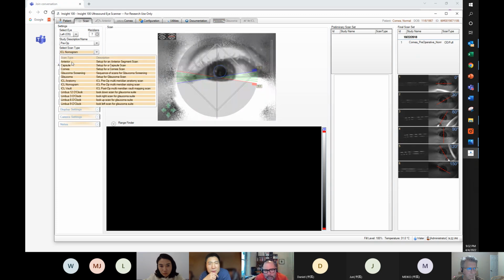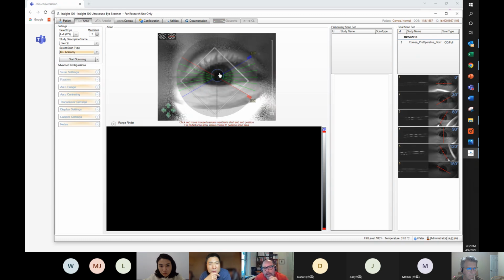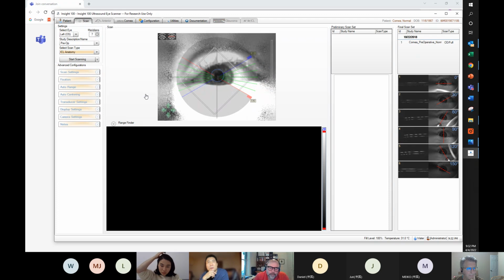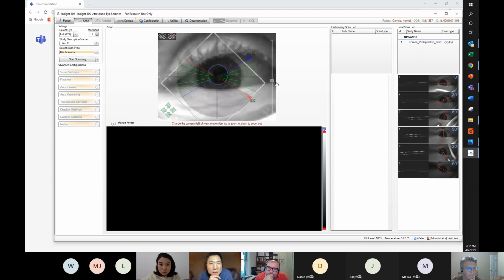An image like that, a little bit higher, will go perfectly fine for an ICL. You see, an image like that will be perfect for an ICL. Absolutely, you're perfect for measuring an ICL right here. You're seeing it all. But it will be absolutely rubbish for an epithelial mapping, because the only thing you're going to see will be that.